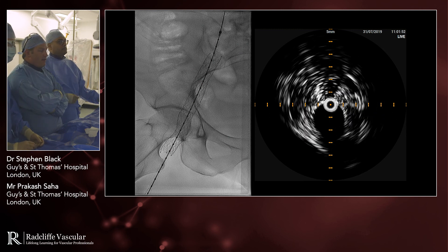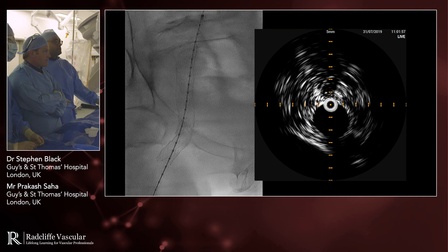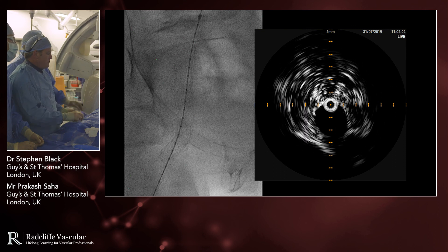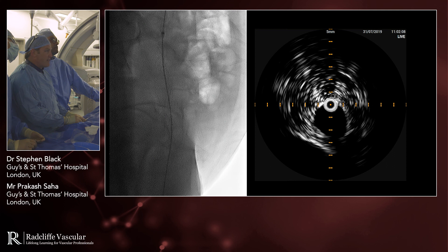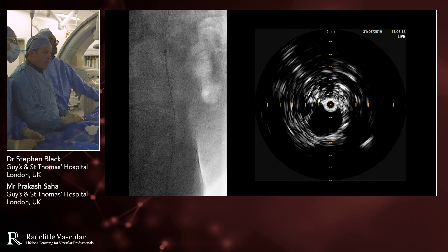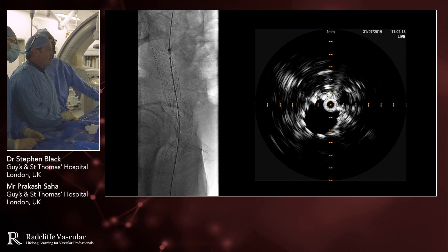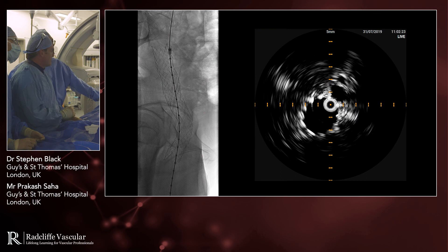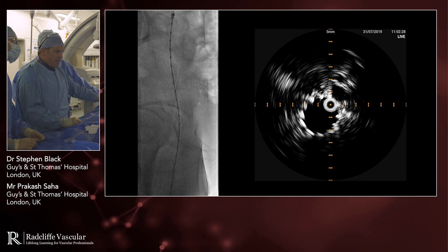If it's coming up and around the bend, then we might be okay with just a single stent. It's still pointing a bit backwards. The trouble is we've got the internal coming off and we're just sitting with the stent on the bottom of the pelvis — it's at a sort of bend point, point of flexion. I'd rather have the flexion going up and around.